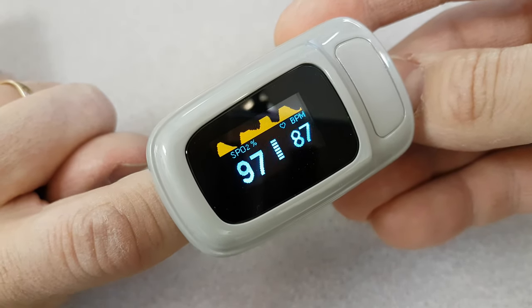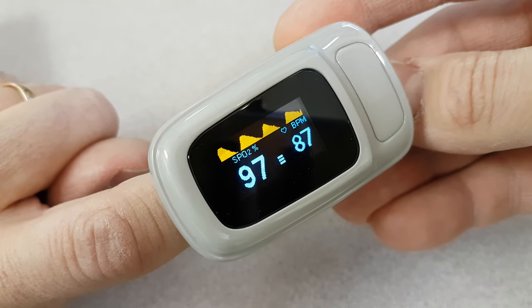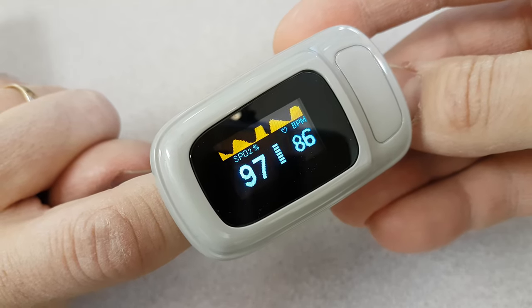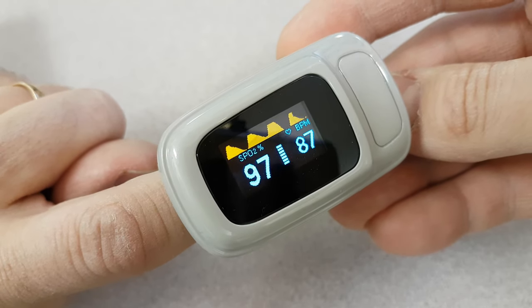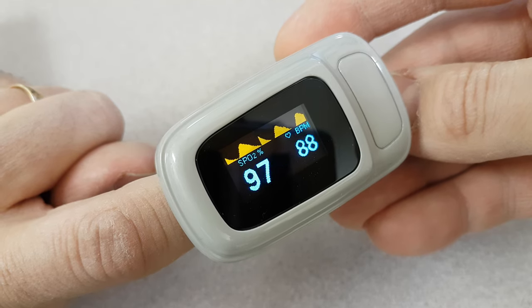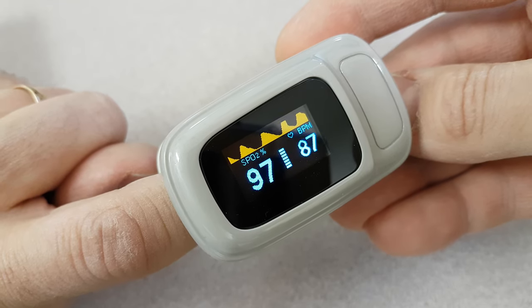I've been suffering with a little bit of difficulty breathing after two days ago when I had some coughing and pain in the chest. Just to be sure, I went and got this oxygen meter. As you can see, it's pretty instantaneous — I have a blood oxygen level of 97, and anywhere between 96 and 100 is good.